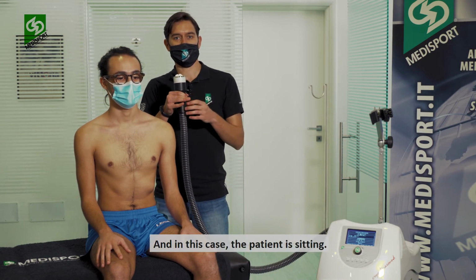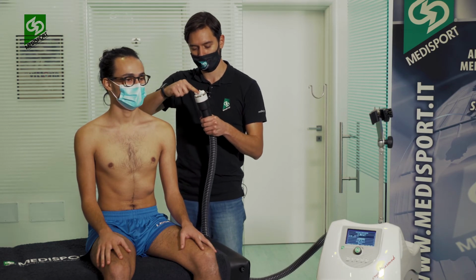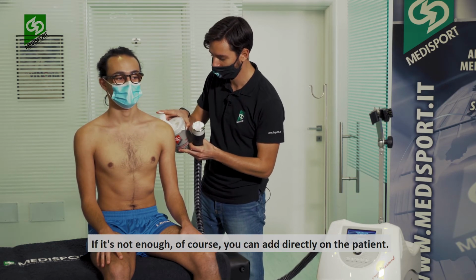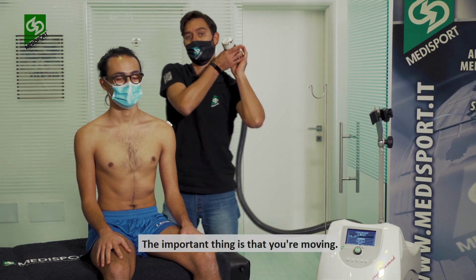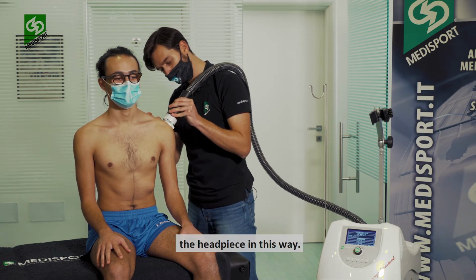In this case, the patient is sitting, maybe it's a little bit more comfortable. So you can apply the cream on the applicator and on the patient as well. If it's not enough, of course, you can add directly on the patient. The important thing is that you're moving. So in this case, you will set the headpiece in this way.